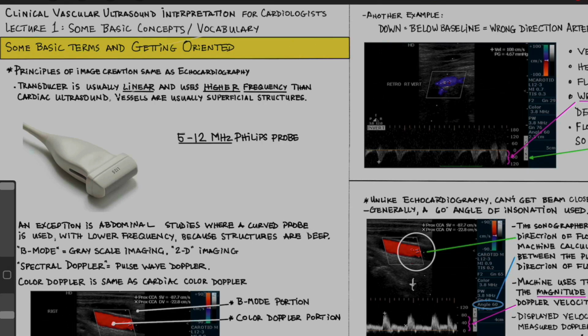Nathan Ritter coming at you with Clinical Vascular Ultrasound Interpretation for Cardiologists. Lecture 1, some basic concepts and vocabulary.